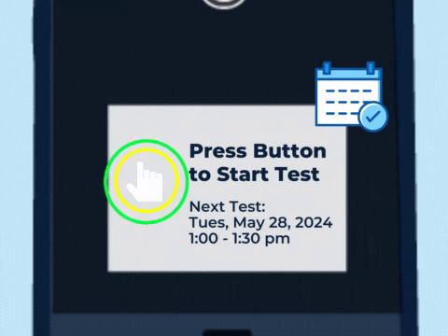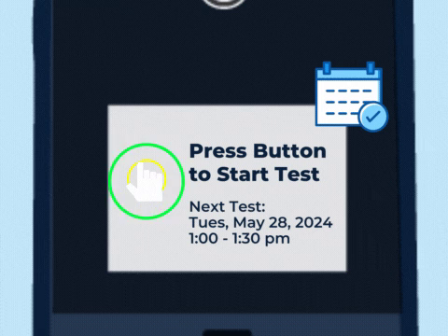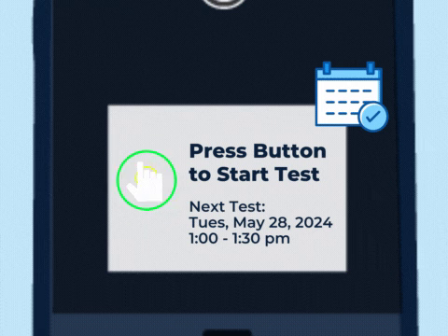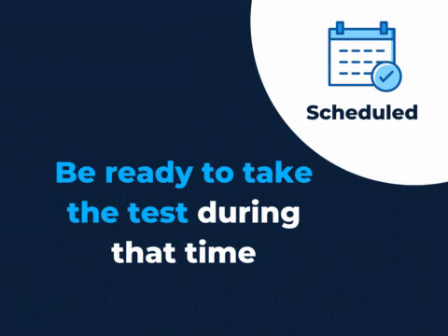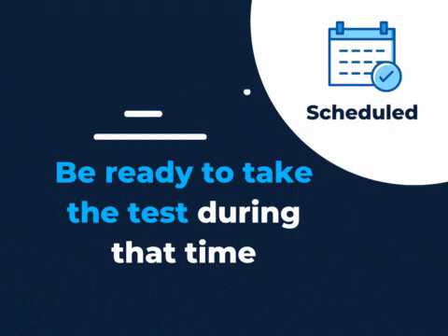If your next test is a scheduled test, your device will display the upcoming date and time of the test window. Be ready to take the test during that time.